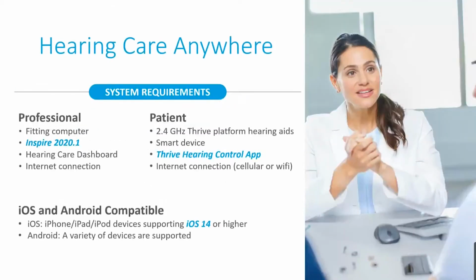In order to have compatibility with Hearing Care Anywhere, the system requirements from the clinician standpoint will be that they have the most recent version of the Inspire programming software installed on their fitting computer, or at least 2020.1 or newer. They need to be logged into their Hearing Care Anywhere dashboard and must have a viable internet connection.